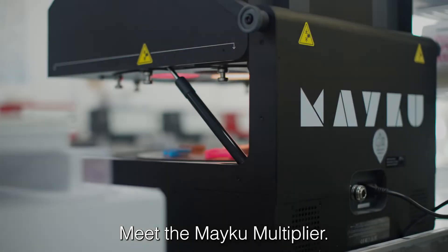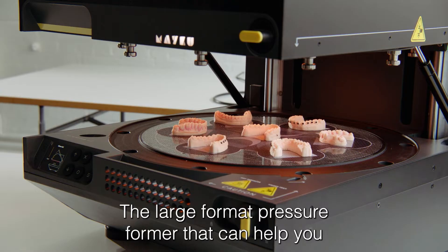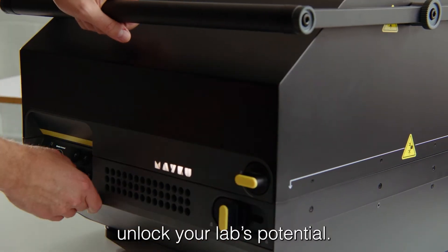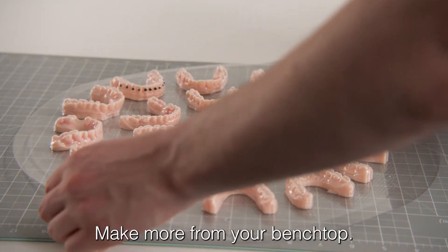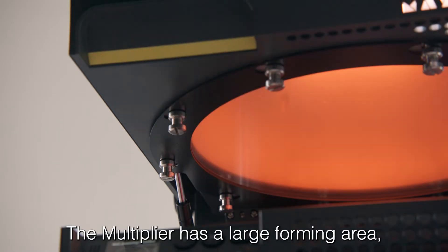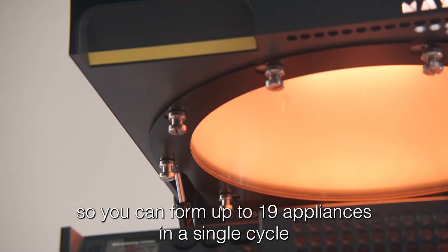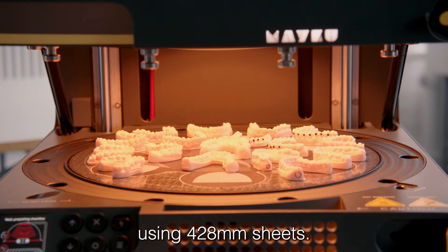Meet the Meku Multiplier, the large format pressure former that can help you unlock your lab's potential. Make more from your benchtop. The multiplier has a large forming area so you can form up to 19 appliances in a single cycle using 428 millimeter sheets.